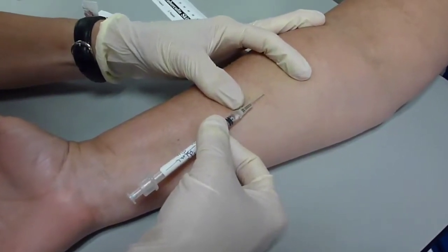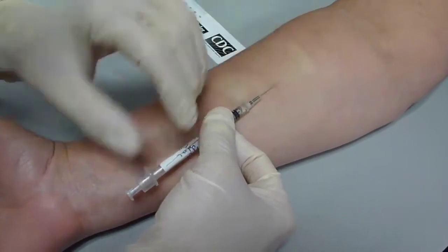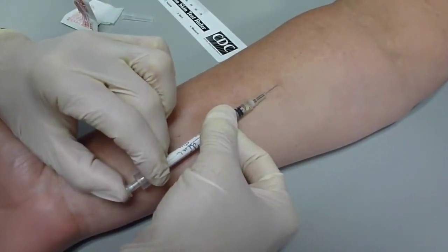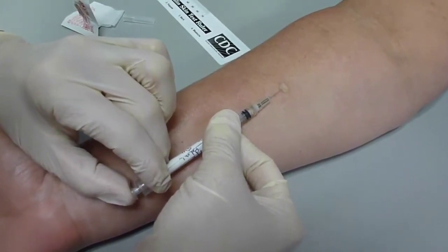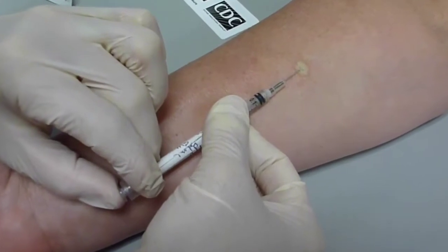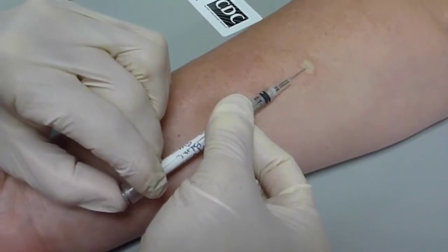When you inject, you want to be sure the entire bevel is under the skin. Hold the syringe tight and inject, forming your nice wheal. Once you've injected all the medication, be sure that you take a nice firm hold on the syringe in order to retract so that your needle does not move.